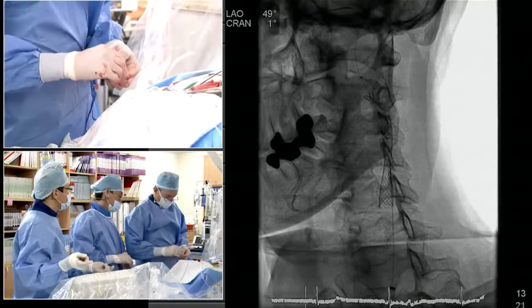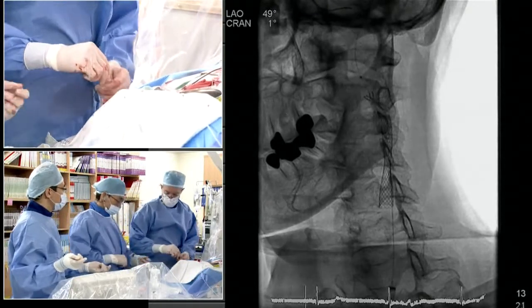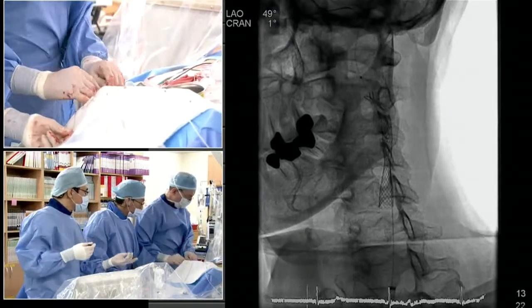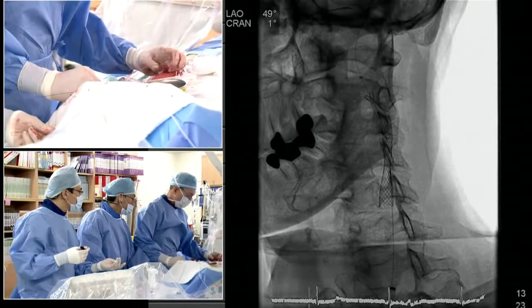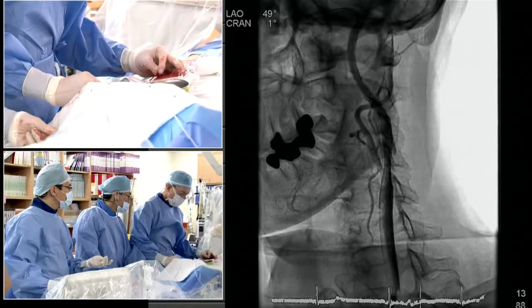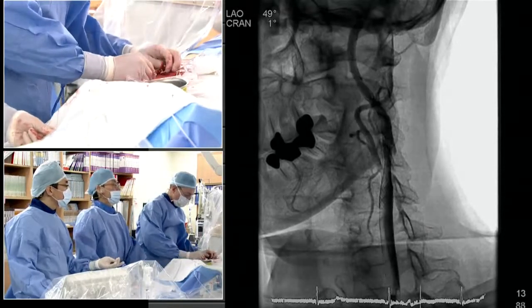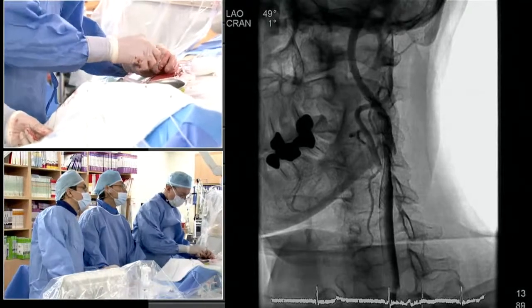Yeah, the wall stent really kind of straightens out curves. It's interesting to do a comparison of a nitinol stent to the wall stent. You'll see that the nitinol stents tend to hug the wall and conform more to it, and the wall stent tends to smooth things out, as you can imagine just when you consider the architecture of it, that it's a woven wire stent that can't really go all the way out to the vessel wall. So I think that's right. This is a very typical wall stent appearance.